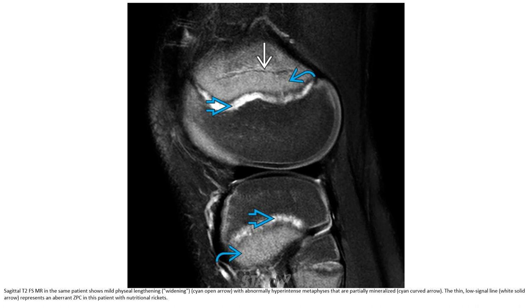T2-weighted MRI in the same patient shows physeal lengthening with abnormal hyperintense metaphysis that is partially mineralized. The low signal line represents an apparent zone of provisional calcification in this patient with nutritional rickets.